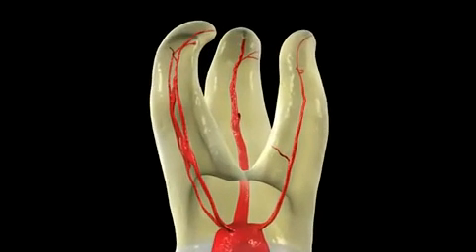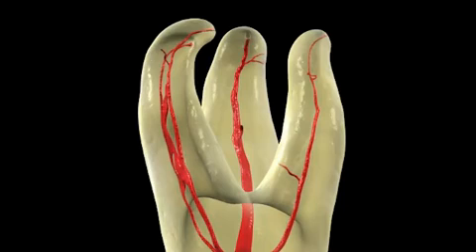Notice the distal buccal root is deceptively simple if you look at the root itself. But if you begin to zone in on the system that moves down through that root, you can see there's multiplanar curvature, and the canal makes an abrupt recurvature towards the distal, and the portal of exit is actually on the distal aspect of the distal buccal root.